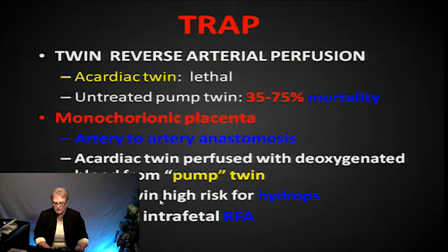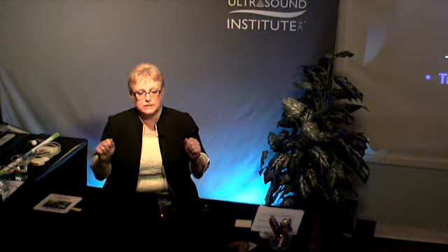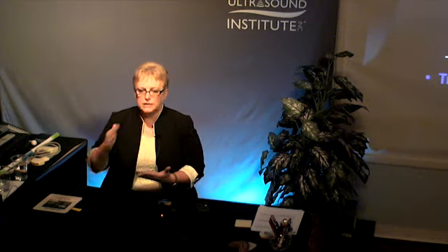The pump twin has high risk for hydrops, and we treat this with an intrafetal RFA, radiofrequency ablation, where you go in there and you ablate those vessels. So if you can diagnose this, the fetal surgeon will come in there, they're standing there when you're scanning, trying to map out where the vessels are. So when they go in there, they already have a plan as to what they're going to do.